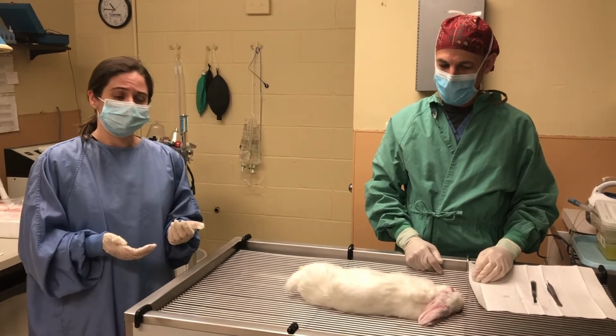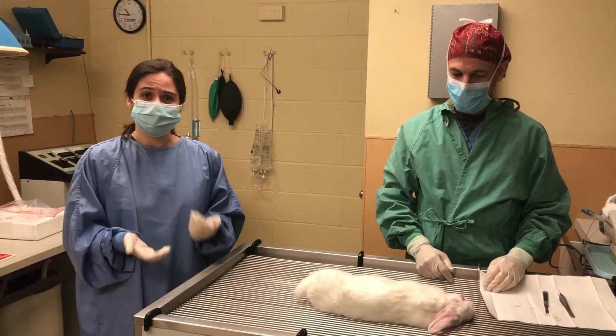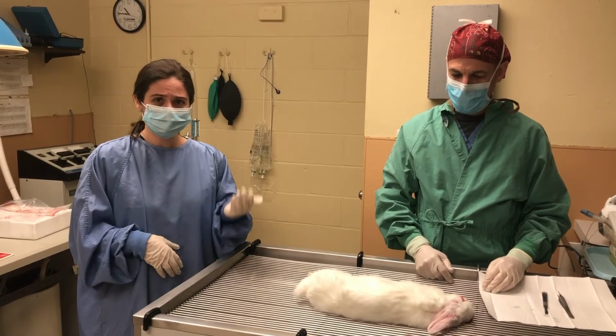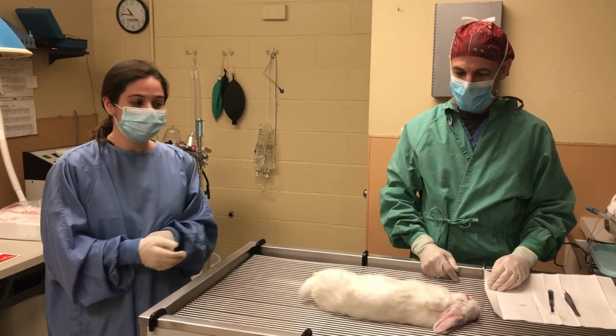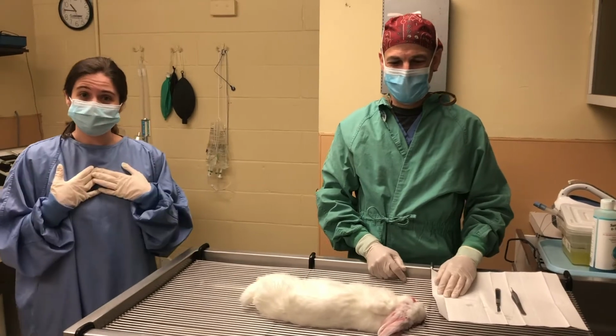They can also be performed for scientific or educational purposes, and they can also be very helpful with diagnosing future patients if they have similar symptoms. So Dr. Goldman is going to be performing the exam, and I'm going to be assisting him.